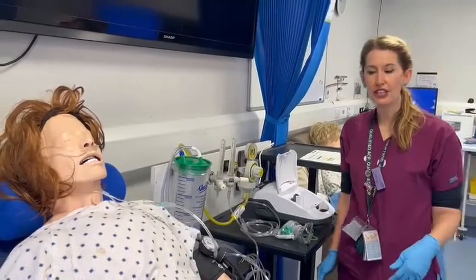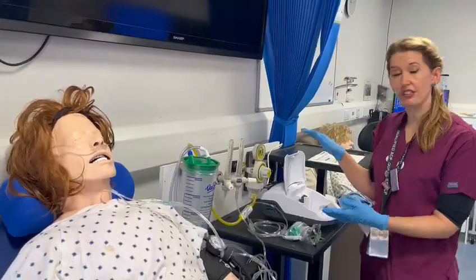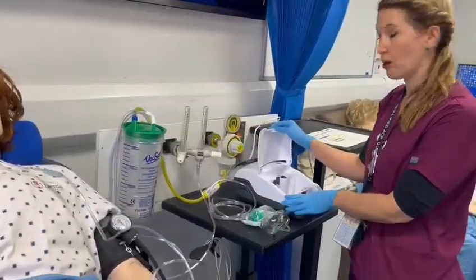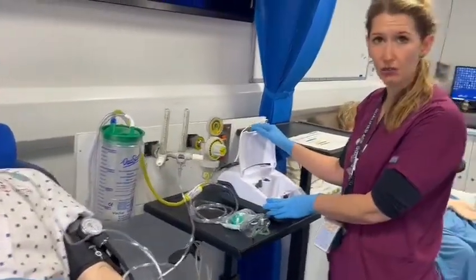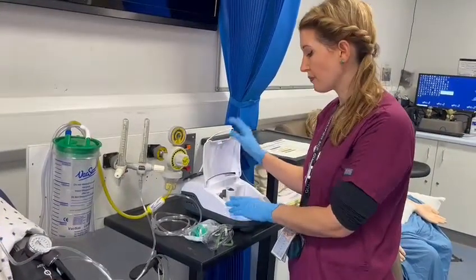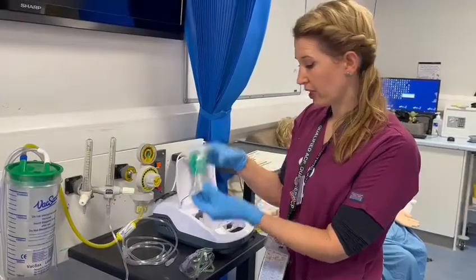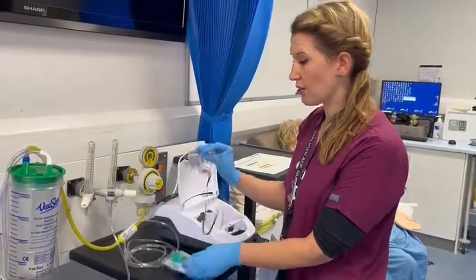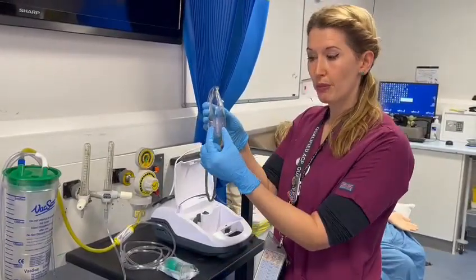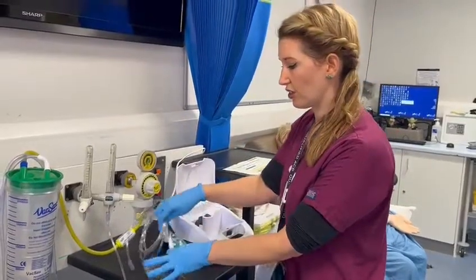We've got a patient here who needs oxygen, and in order to deliver a nebuliser you need one of these air-driven compressor machines, which you'll be able to get from the equipment library. You're going to need your nebuliser chamber, a mask with a simple clear port on the end, and some oxygen tubing.